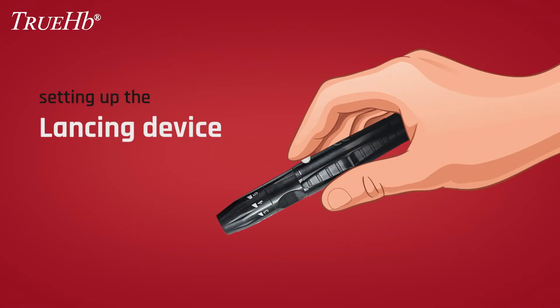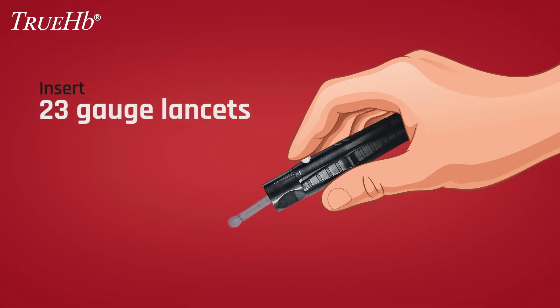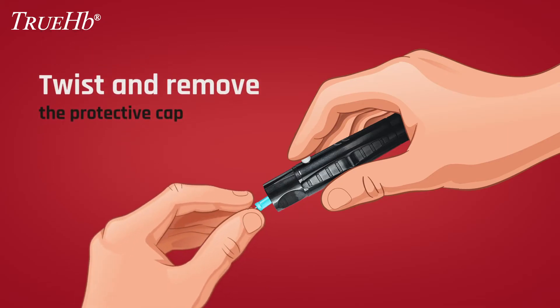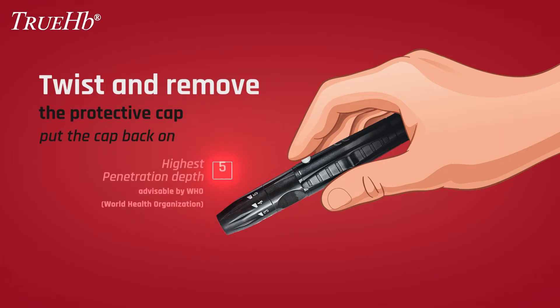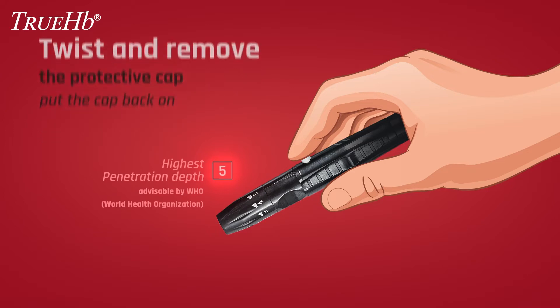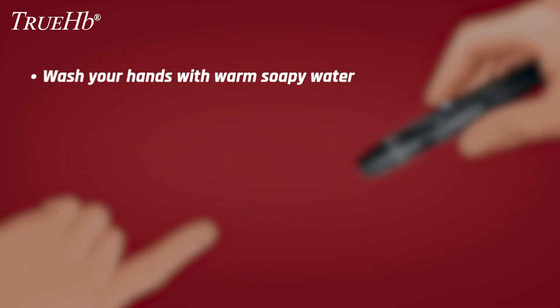Setting up the lancing device: Remove the cap from the lancing device and insert the 23-gauge lancets which come with the package. Twist and remove the protective cap from the lancets and put the cap back on the lancing device. Setting 5, which is the highest penetration, is advisable by WHO, the World Health Organization. The lancing device is now ready to perform the hemoglobin test.